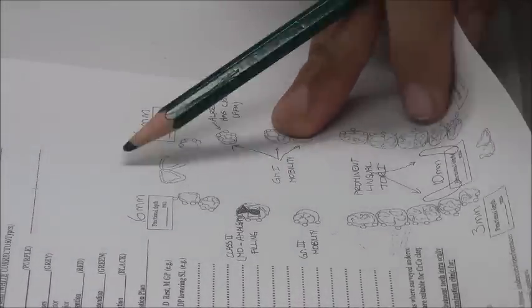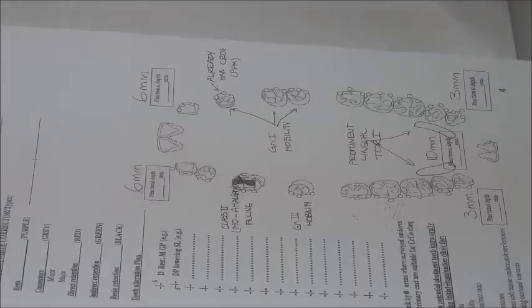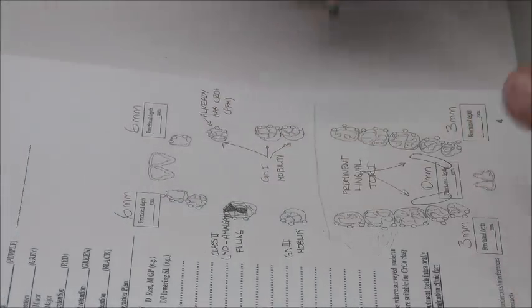I'm going to go into the point about mobility, and I'm going to speak about some of the mouth findings. Let's go, the upper Kennedy classification: Class 3 mod 5. But the 8 has grade 3 mobility. What do we do with teeth that have grade 3 mobility? Extract. So this is planned for extraction. What is our design now?